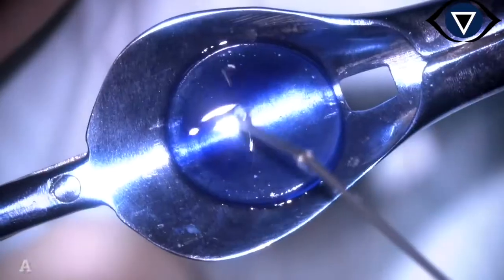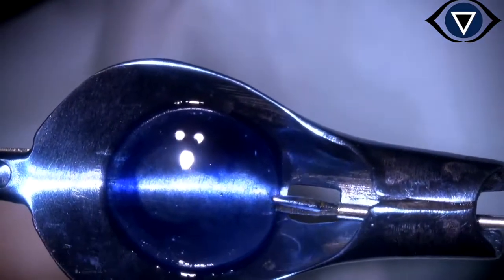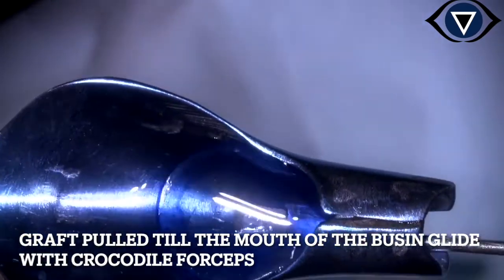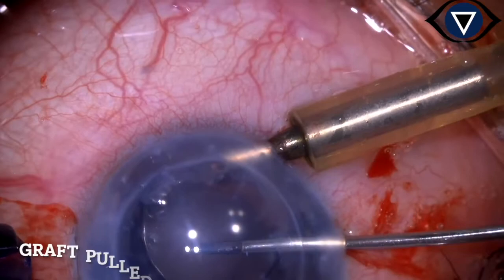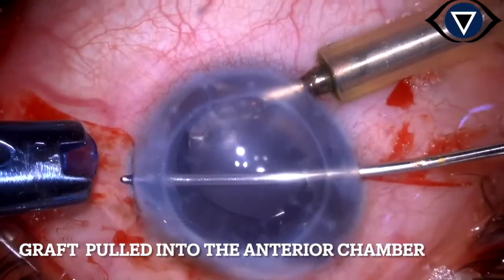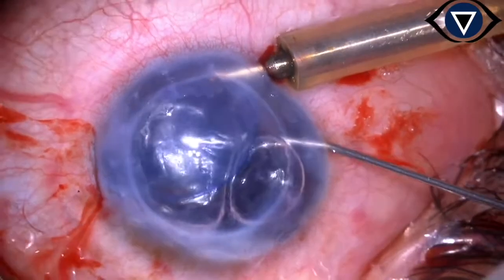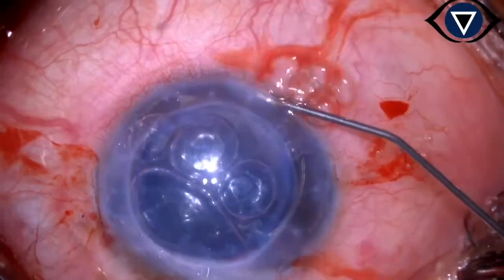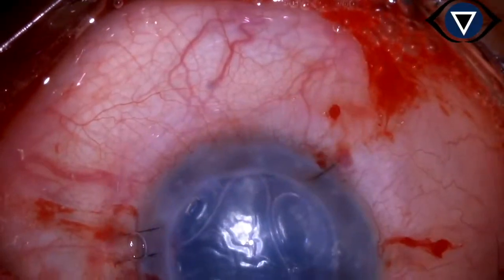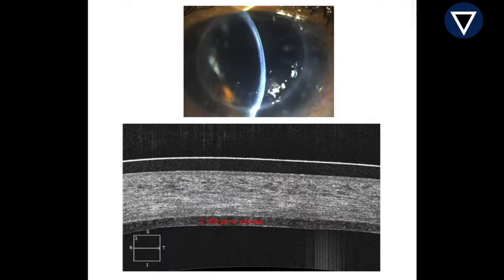So as we have seen in the course of this video, this particular lenticule had been exposed to femtosecond laser, excimer laser and also applanation while the inlay was being harvested on the femtosecond machine. But as we will see, this patient after surgery has been doing well. The graft has cleared, there is no edema, and improvement in vision has also been seen. These are the post-operative photographs of the patient.